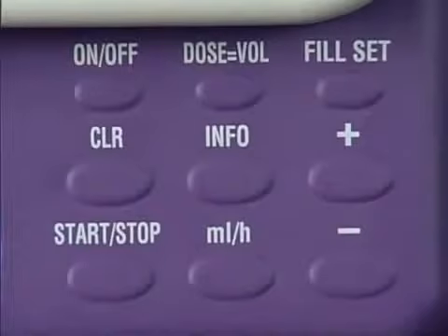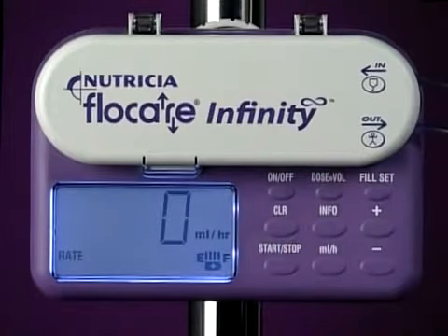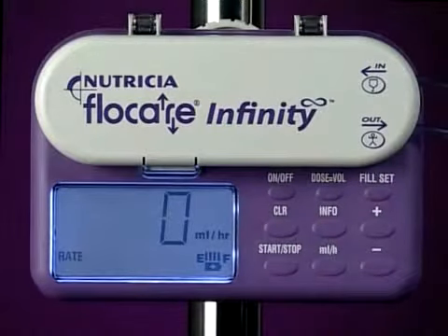Simply clear the volume fed by pressing the CLR key. The display will now default to the last feeding program and show the last flow rate that was entered. At this stage, the Flowcare Infinity pump is in hold mode and is ready for programming.